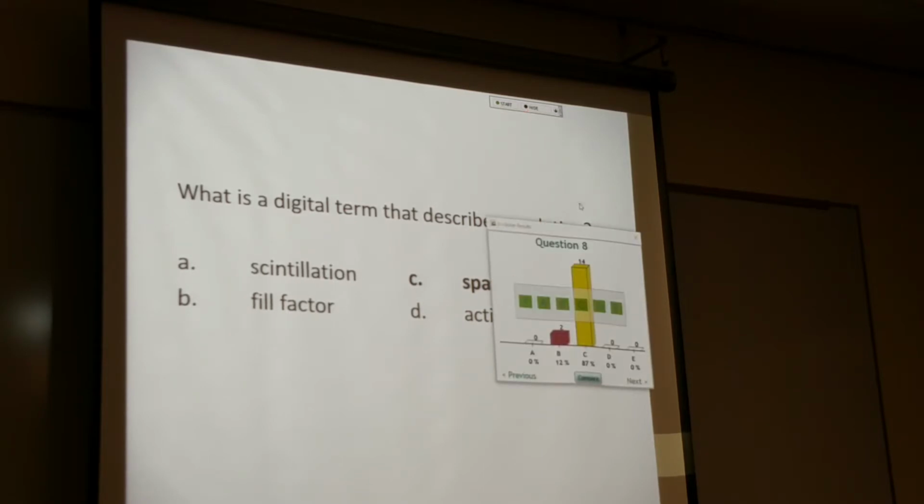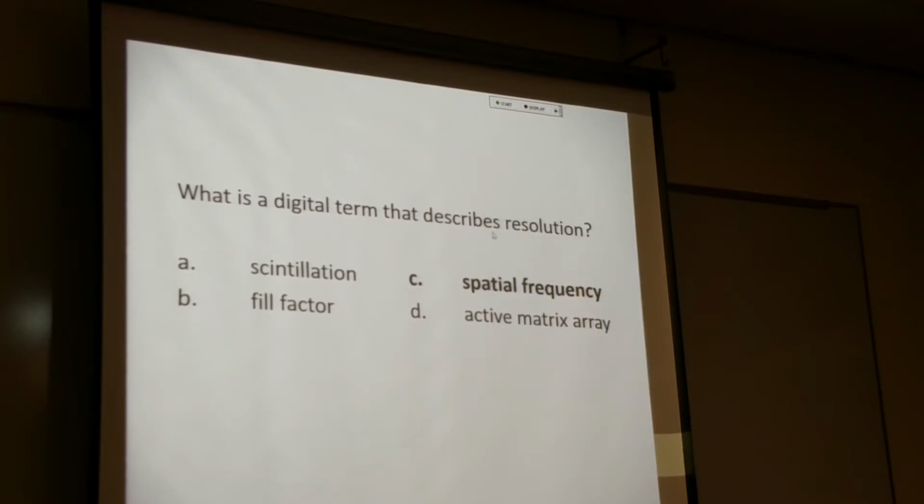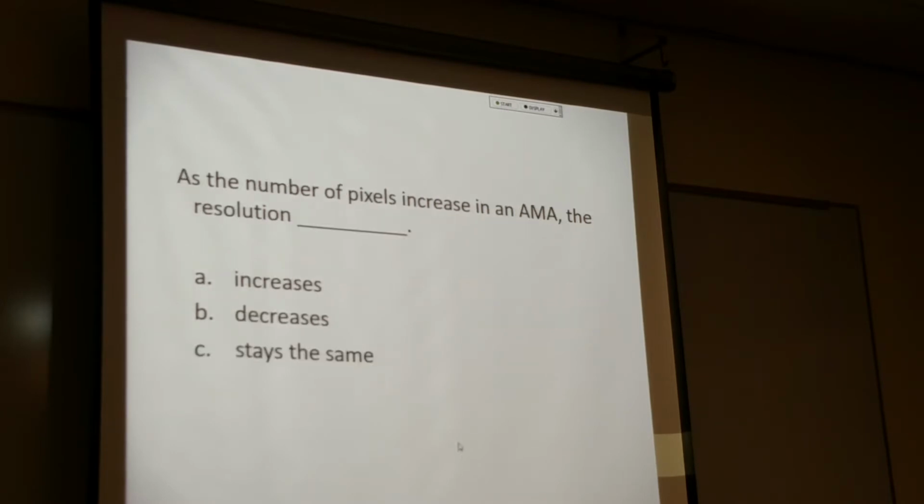Almost. Okay, we just talked about that on the MTF. Spatial frequency is just another term for resolution. A lot of questions on resolution and what affects it.